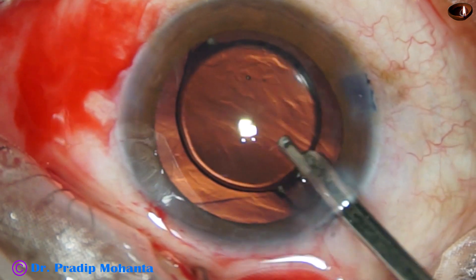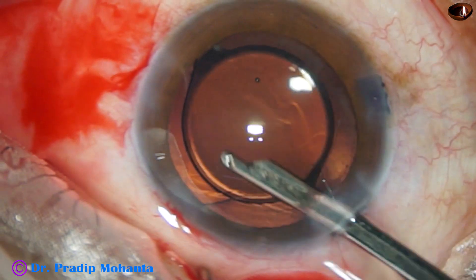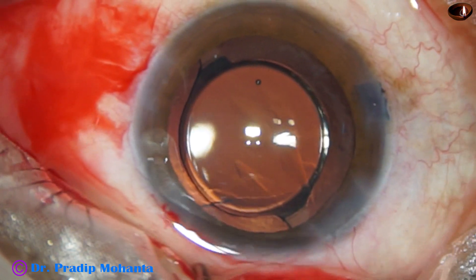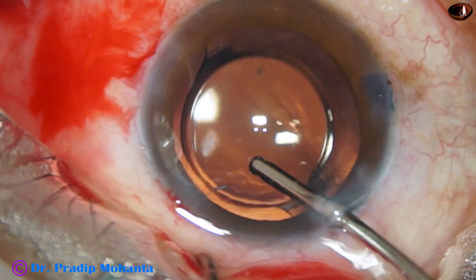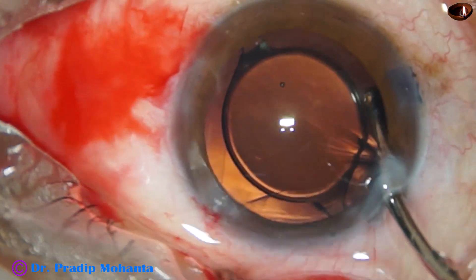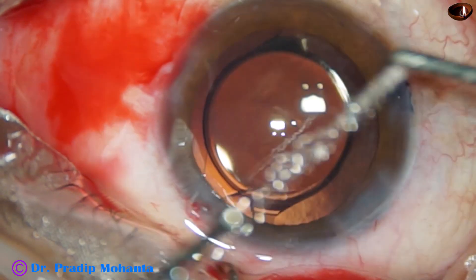I remove the viscoelastic, but cannot go behind the IOL with the Simcoe, so I remove the viscoelastic from the anterior chamber only. I then take the bimanual irrigation-aspiration, irrigate the anterior chamber nicely, and remove most of the viscoelastic. I go to the right edge of the lens, go behind the IOL at that point, and irrigate the capsular bag to remove the viscoelastic from it.